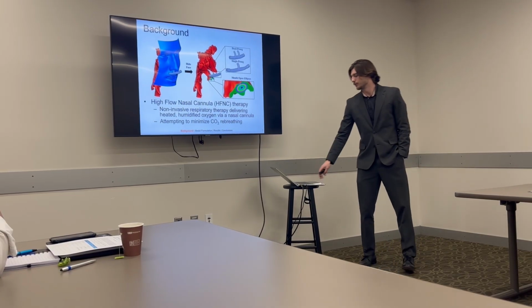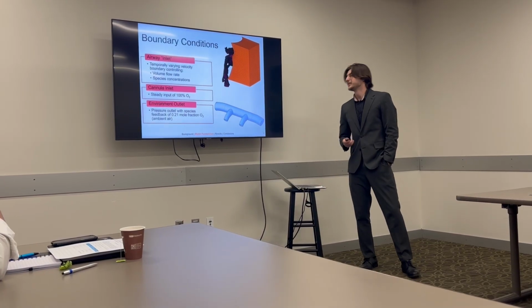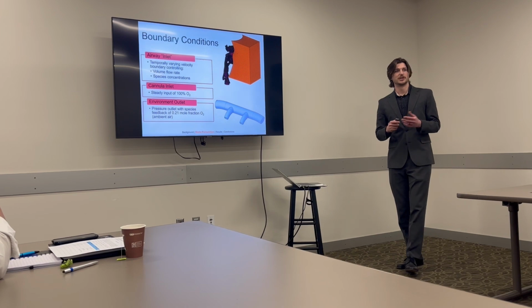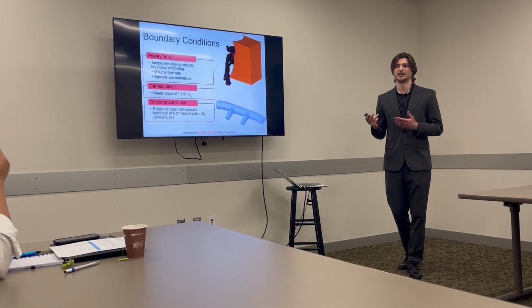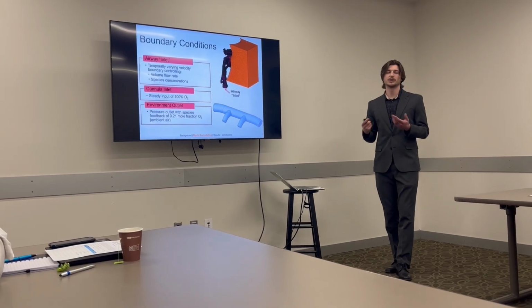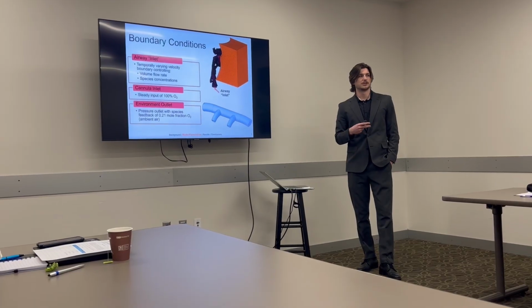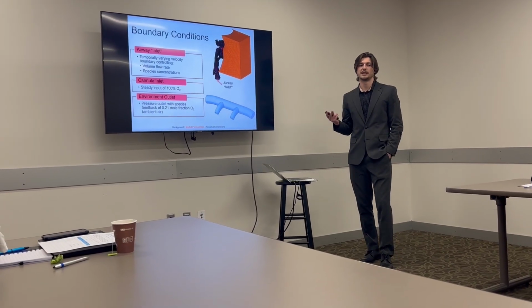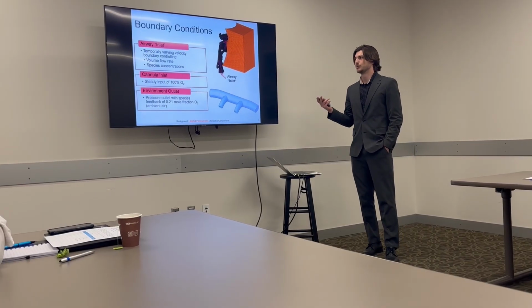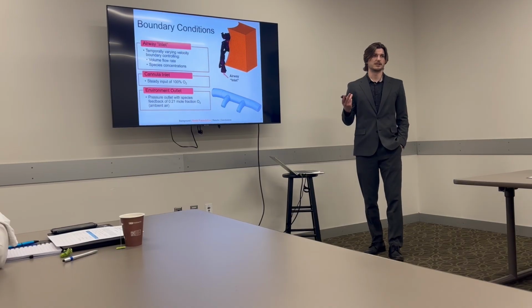Now, a quick overview of the boundary conditions. So we have the airway inlet. Inlet is in quotes because it functions as both an inlet or an outlet depending on where we are in the breath cycle. That's the base of the trachea here. It's a temporally varying velocity boundary in which volume flow rate and species concentrations are being set at each time step. The volume flow rate is being set to follow a realistic breathing curve that we collected using an ASL 5000 breathing simulator.